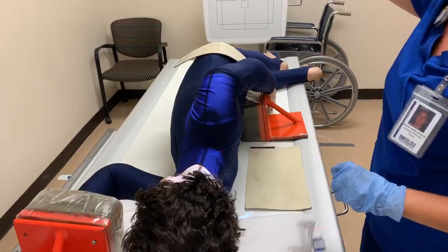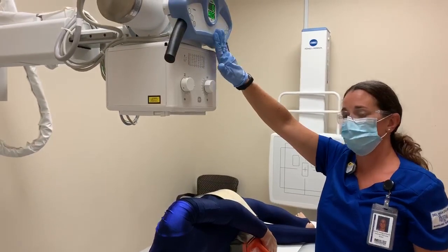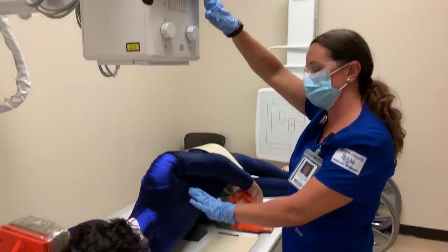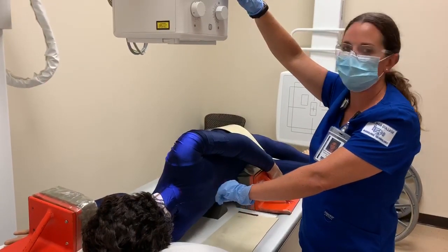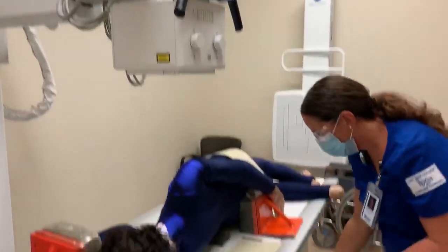So that's good. Our technical factors, you're still going to use a 40-inch SID. Now for swimmers, the erect position, which is 60 to 72, is preferred. However, we're using Molly and we're doing it tabletop, so 40 inches. And you can do that with your patient if they can't stand. So check to make sure that you have your 40 inches.